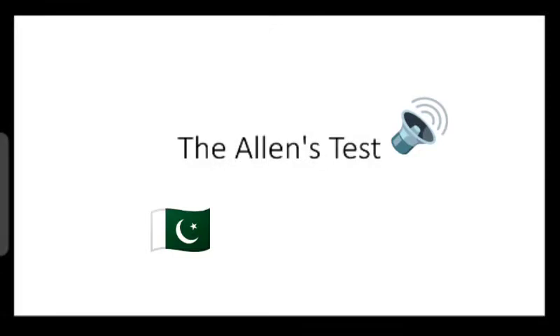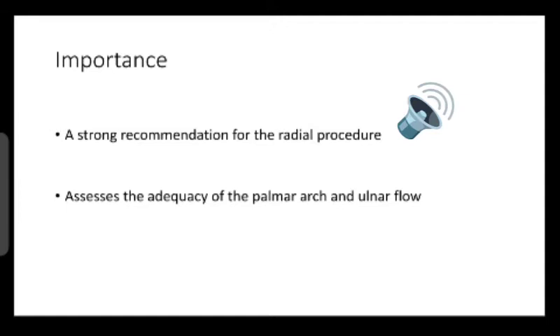So today we will discuss the Allen test, the modified Allen test, and grading of waveforms in Allen test with plethysmography. Importance of Allen test is that it's a strong recommendation for the radial procedure. It assesses the adequacy of the palmar arch and the ulnar flow.